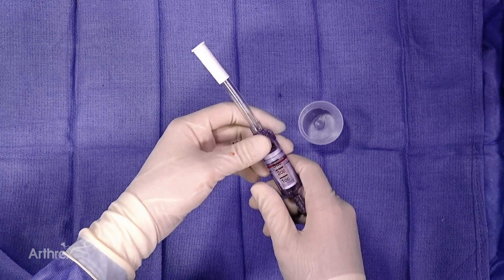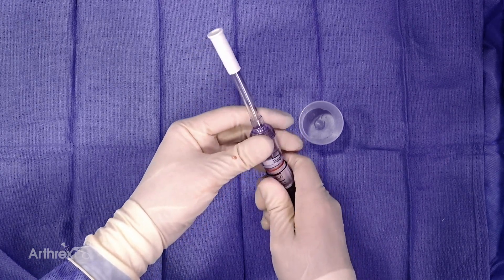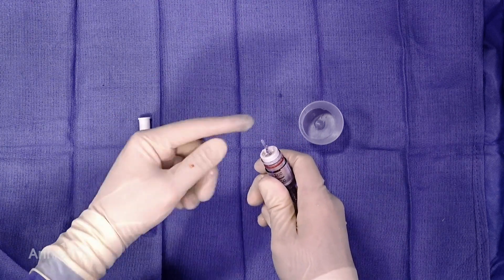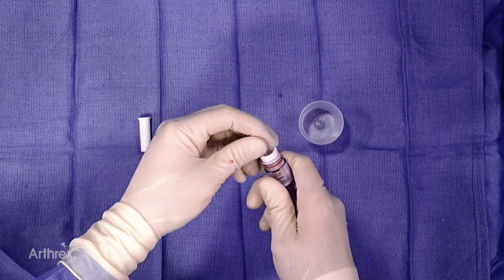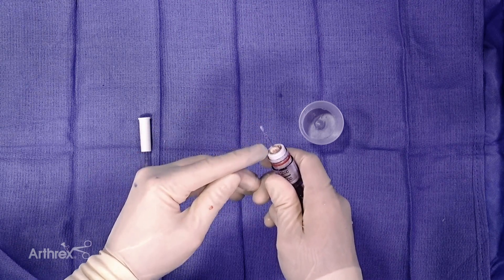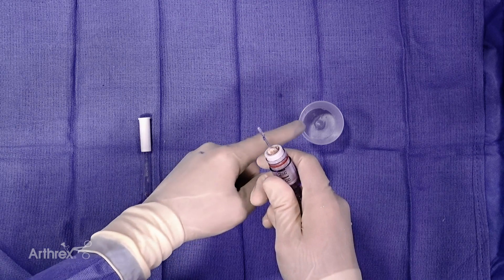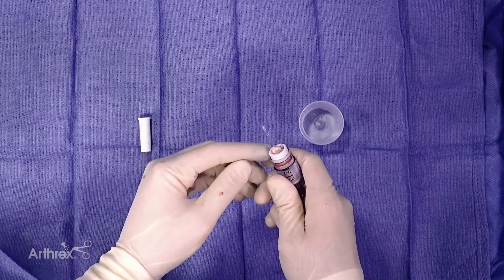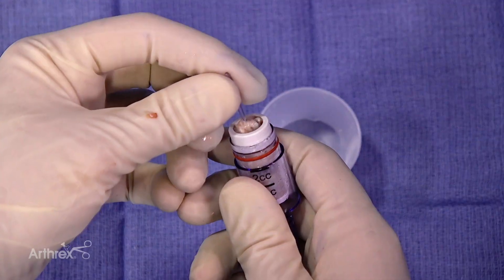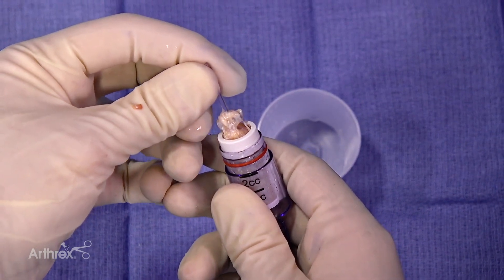We've disconnected the GraphNet now, and the surgical assistant on the back table will disconnect the top portion. There's a plunger right in the middle that we'll be able to pull out. If we see bursa tissue on top of the plunger, we'll be able to put that directly into the sterile cup, put that into a syringe, and then use that at the completion of the case. We can see this bursa tissue — it's very adherent, very gummy, viscous tissue.